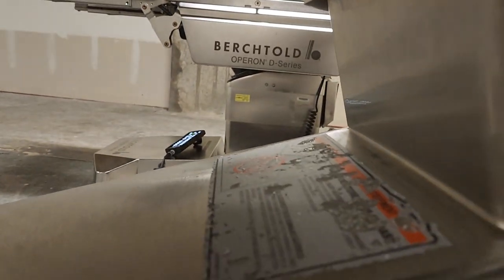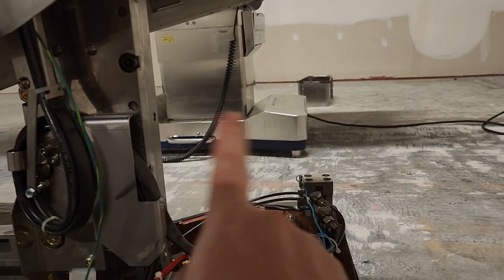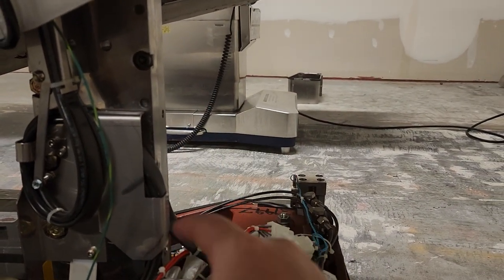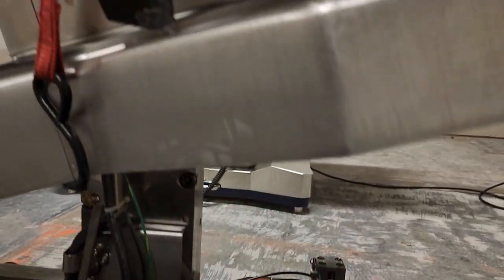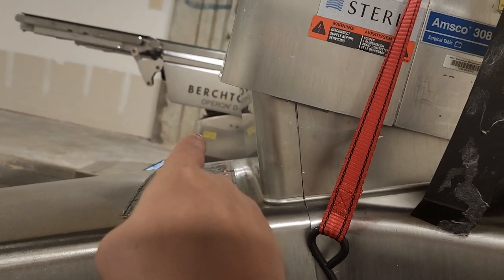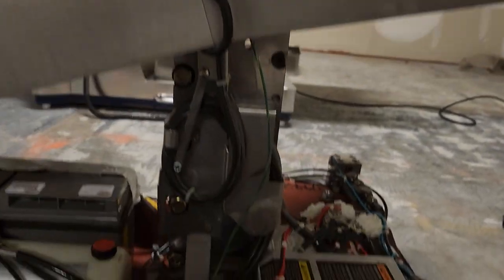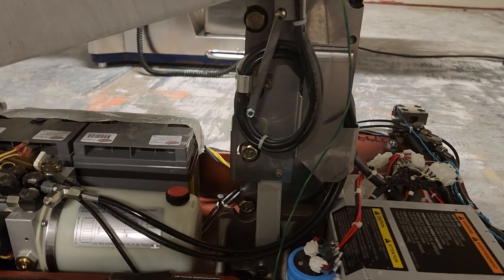Over here I've got a Berchtold unit, and this one doesn't center, so it needs to be calibrated. I checked the cable and everything and it looks good. I just need to find the software for the Berchtold — that's for the Operon D850 — so if you guys know where to get the software for this, I'd love to know. All I have to do is connect the laptop to it and calibrate it.